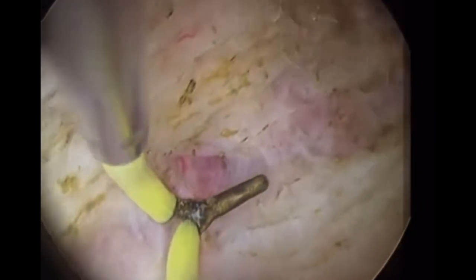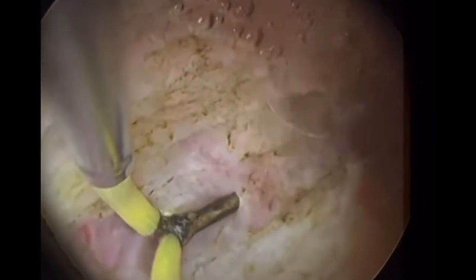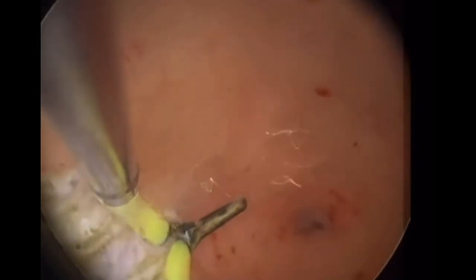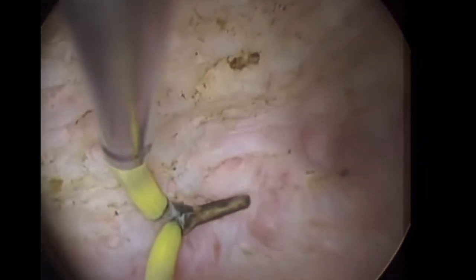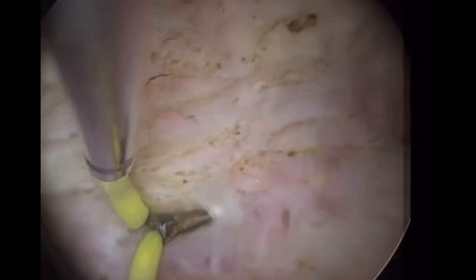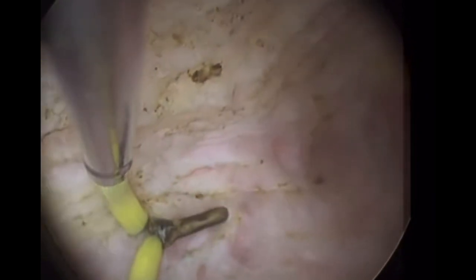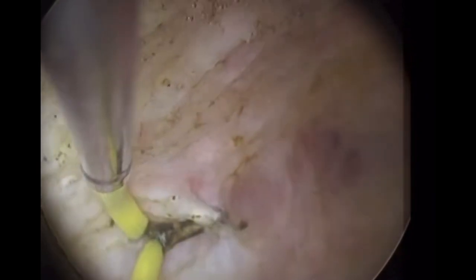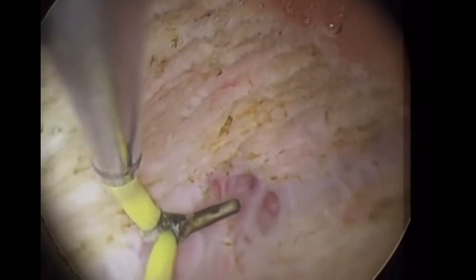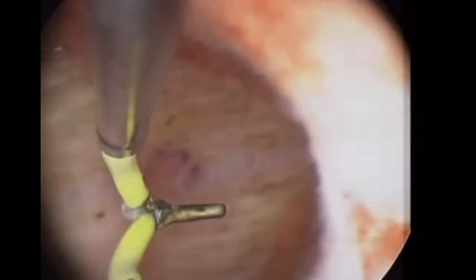My dear friends, septum surgery is not just cut and forget. In many instances, the surgeon might cut the septum perfectly and have a beautiful postoperative cavity, but still there is no pregnancy. The key to success is to achieve equal retraction of fibers, which results in equal thickness of the anterior and posterior wall. Keep watching — more tips coming.